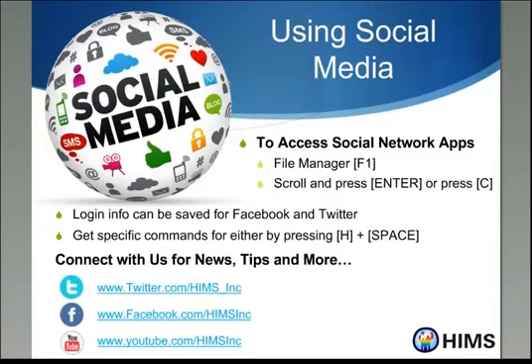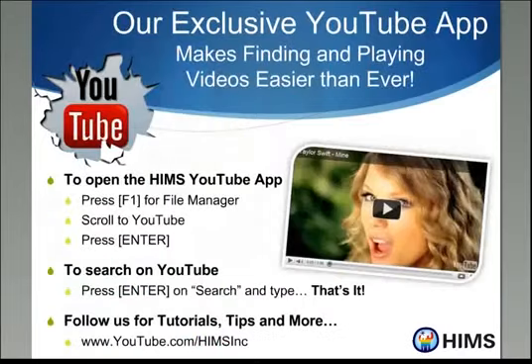File Manager. And from File Manager, I could scroll to the Media Center, or I could just press M. We will scroll. Word processor, email, media. And we'll press Enter. Media Player. And from here, I'm inside of the Media Center, and I'm at the Media Player. I could scroll through until I get to YouTube. FM Radio, Daisy Player, YouTube. And we'll press Enter on YouTube.